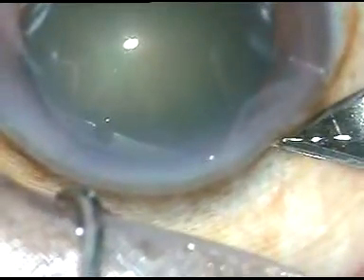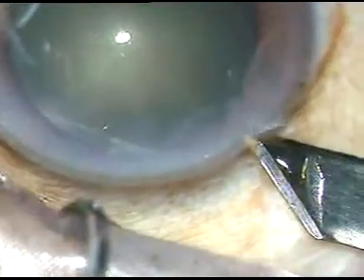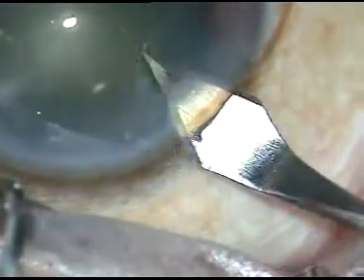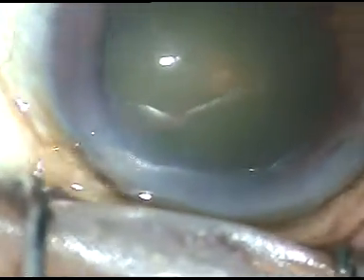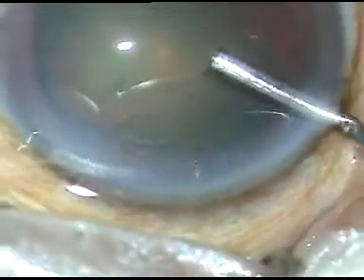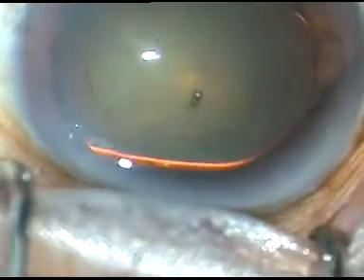Make a small vertical groove, engage the tip of the keratome, advance forward, and then enter into the antechamber. This is the main incision with a 2.8 mm keratome. Dear colleagues, this is phacoemulsification of a cataract with grade 3 nuclear sclerosis.